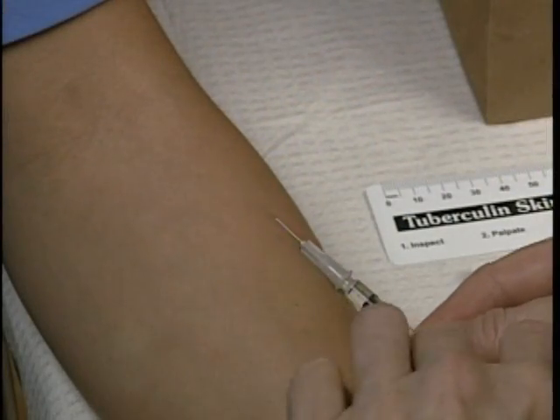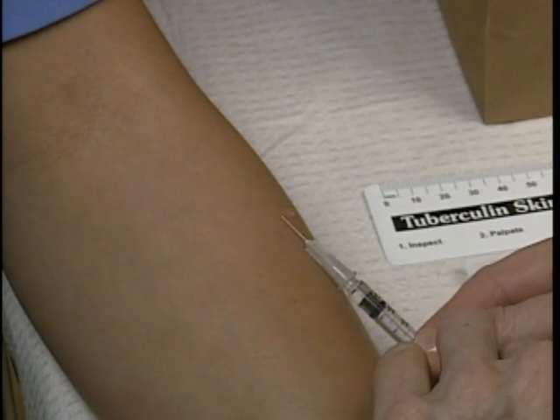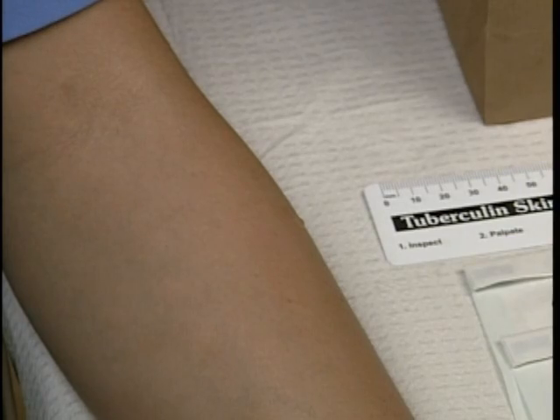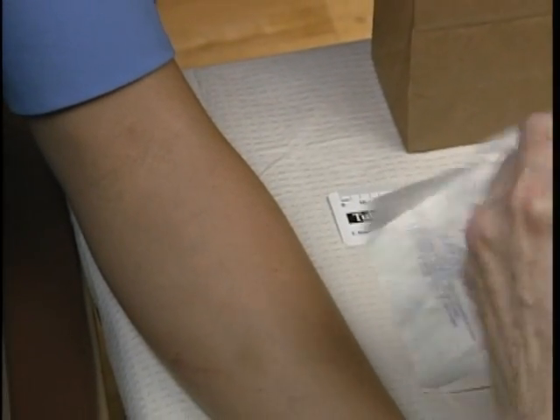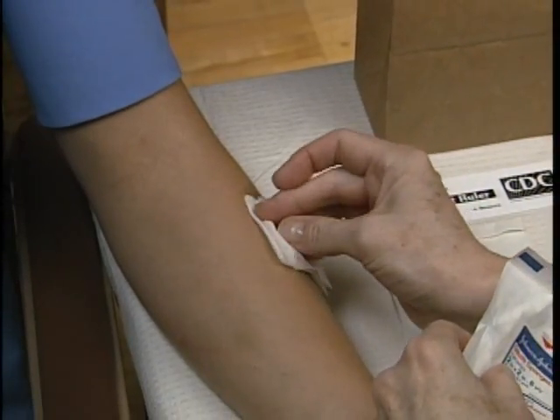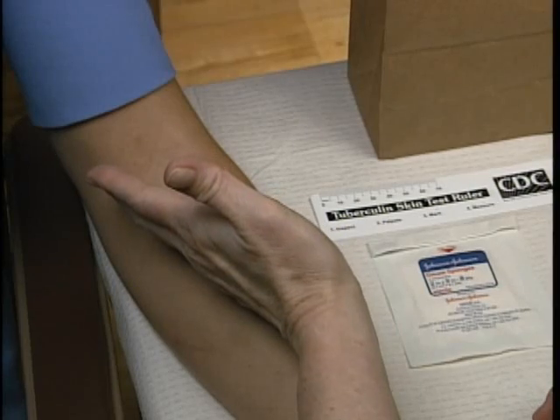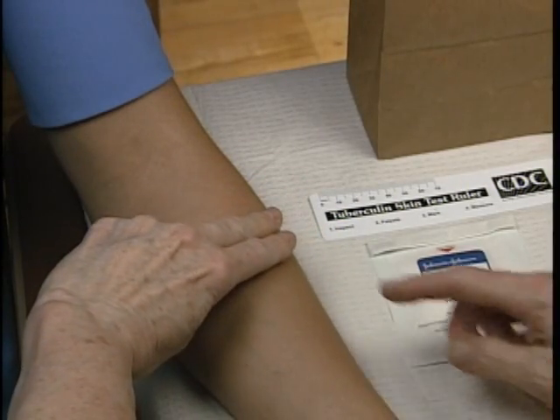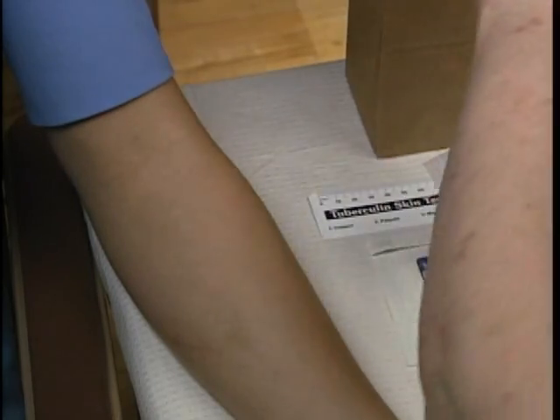If leakage occurs at the insertion site, the needle bevel may not have been inserted far enough for the bevel to be covered by the skin. If the tuberculin test must be repeated, use another site at least 2 inches or 50 millimeters from the original site, or use the standard alternate placement site. You will need to indicate this alternate site when you fill out the record-keeping forms.